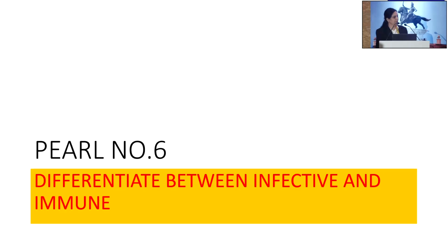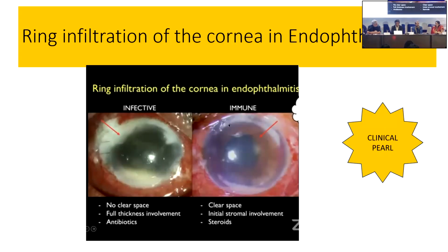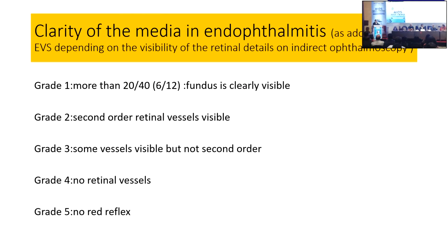So the answer is because in early stages of infective endophthalmitis, B scan may be anechoic, because it takes time for the clumps to form so as to throw echo. Otherwise, echo may not come also. So it's more often a clinical diagnosis rather than an ultrasound diagnosis.